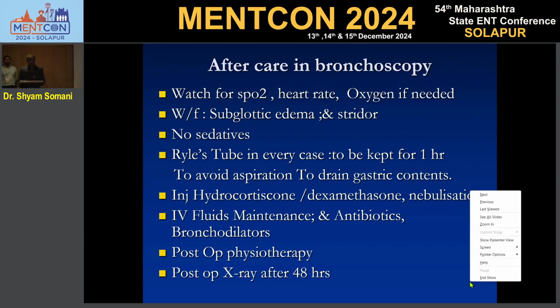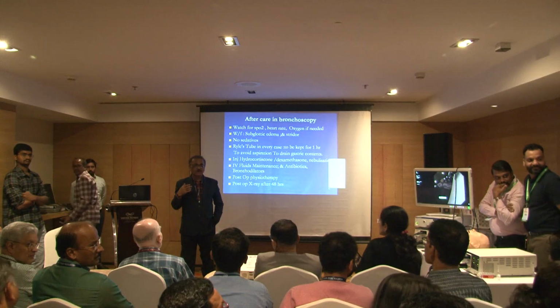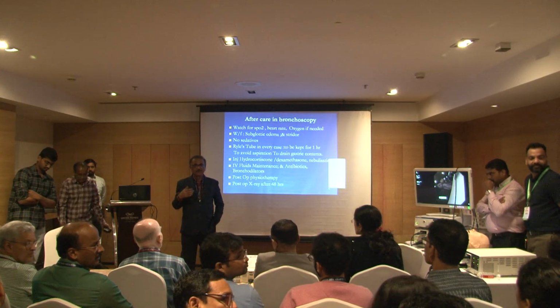So any questions? Because I was more on the technical part, so I was more focusing on that part. So regarding technique or removal or any questions or practical importance, anybody who has? Putting the scope in the left bronchus is not an easy job. So what maneuver do you do?